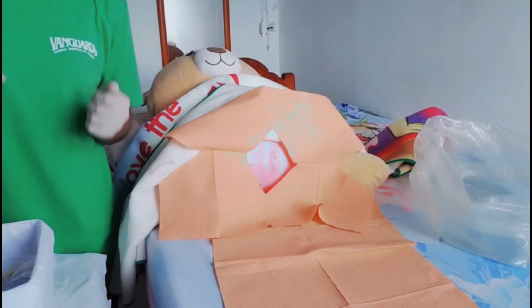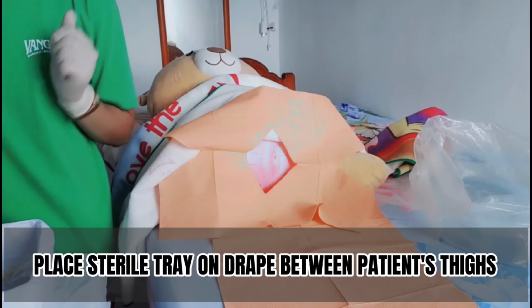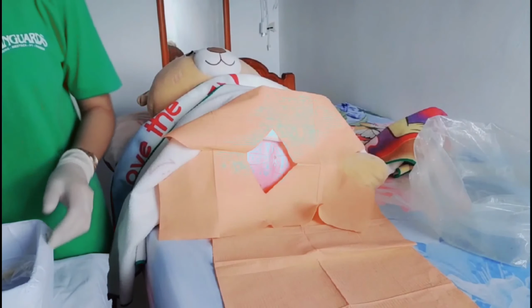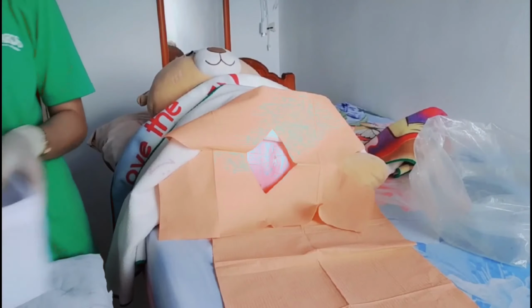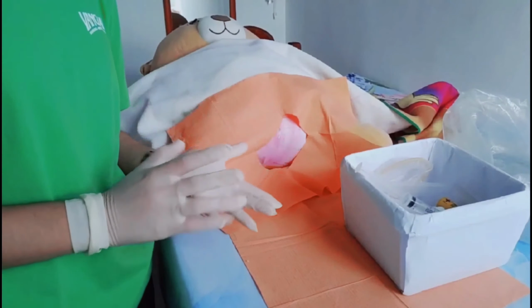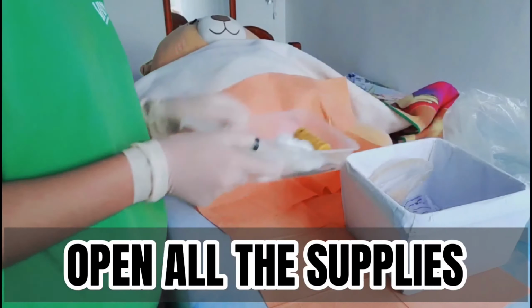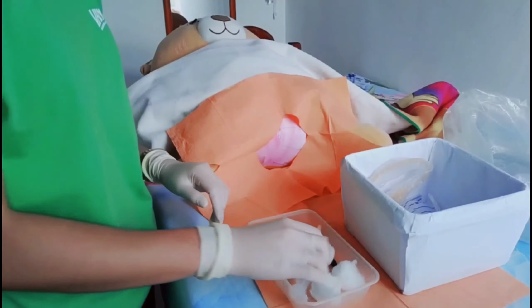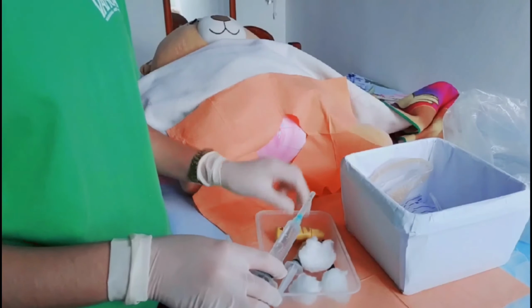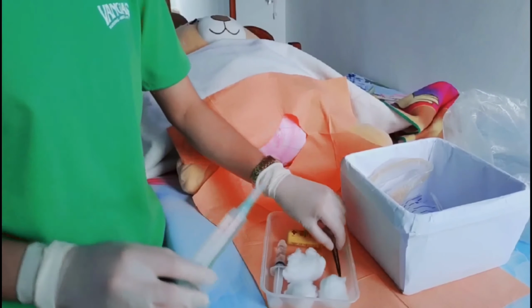Then we are going to place the sterile tray on the drape between the patient's thighs. This is to provide easy access to supplies. Next, we are going to open all the supplies. We have here 10 cc sterile water, cotton balls, lubricant, betadine, and the forceps.